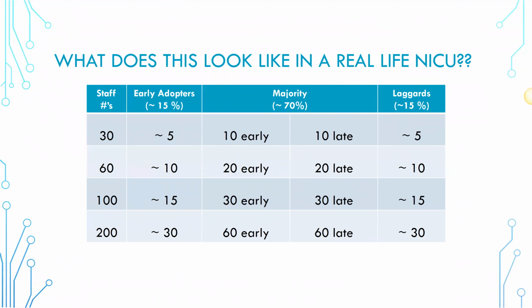So I think one of the biggest problems that we see with aEEG is that people don't use it often enough. And it's important, I think, to not just think of it as a cooling tool, but to think of it as really a day-to-day tool that can be useful for a variety of patients. And there really are a ton of data always evolving around the different populations and publications around that use. So I think it's important to use it frequently, or your staff will not get enough exposure.